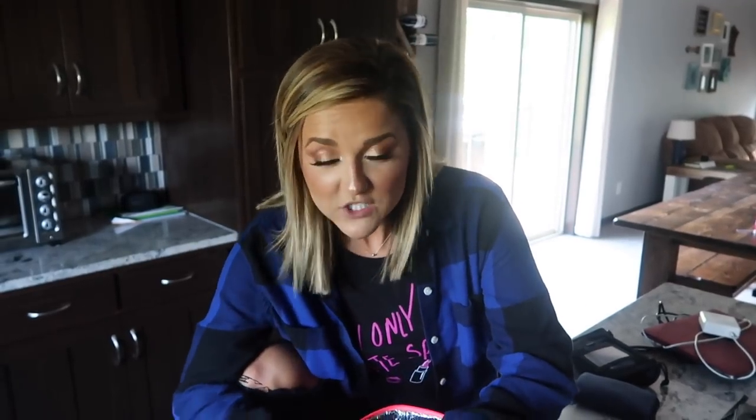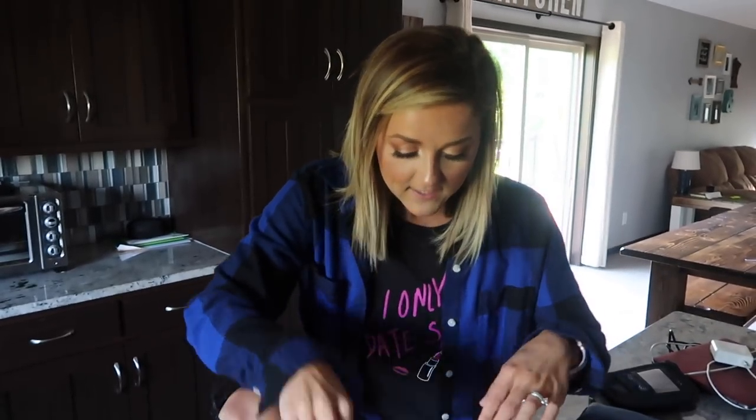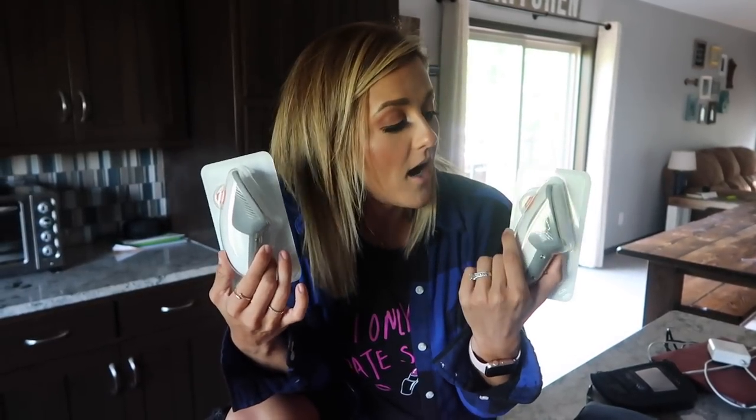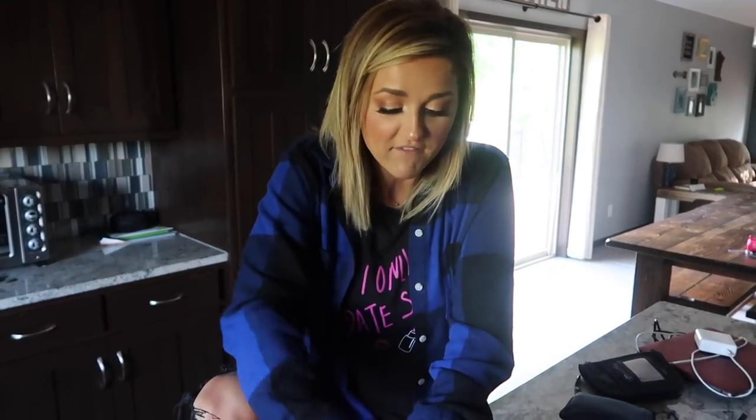Another thing that's super important is the charger — this is for her Dexcom. We've got to charge it. And then her Dexcom G6 insertion things. We are bringing two. We're only staying in Colorado for four days, but you guys, you can never be too safe.